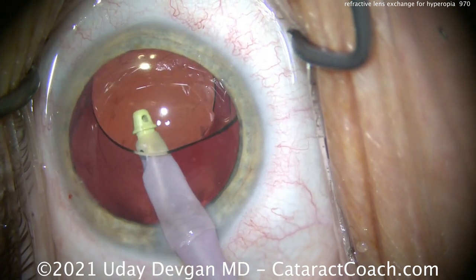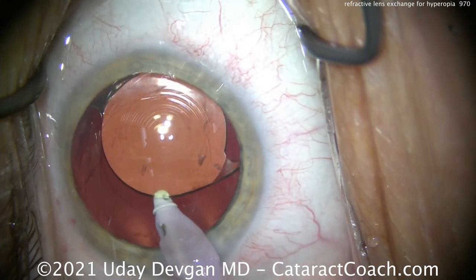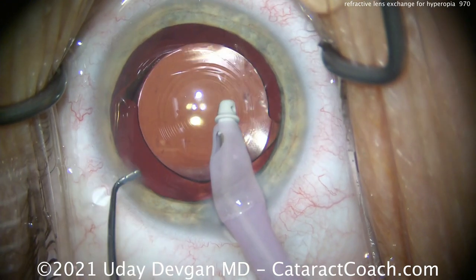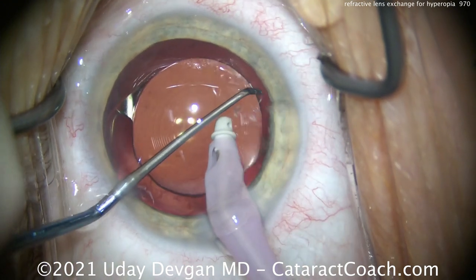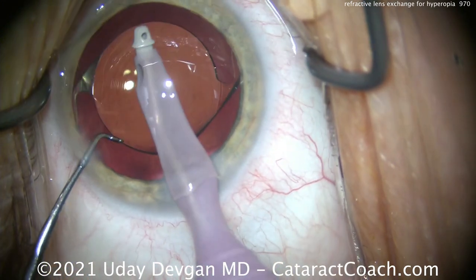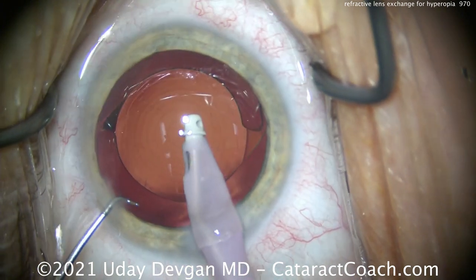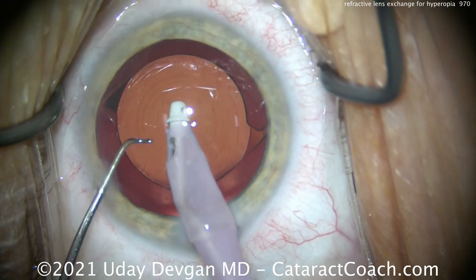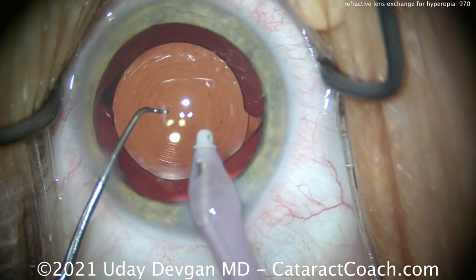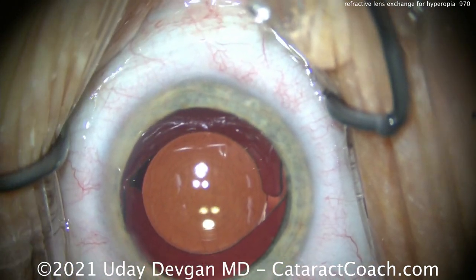The second thing is we are taking out a lens that was clear and replacing it with a diffractive trifocal lens. This lens gives a very wide range of vision from near to intermediate to far, but it does so at the expense of a little bit of contrast — contrast will be slightly less. Also, the diffractive rings will cause nighttime halo and glare around lights. For this patient, these were acceptable and relatively minor issues, and in the post-op period this patient was absolutely thrilled.